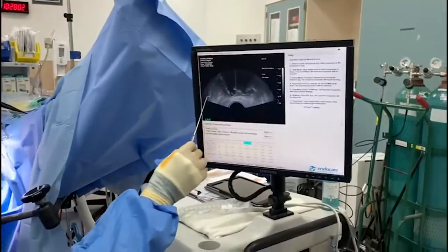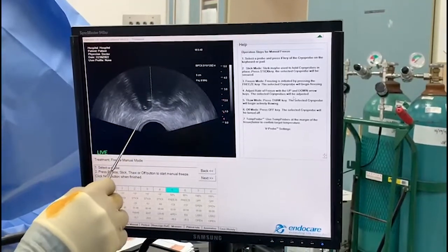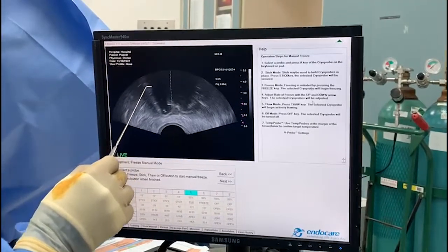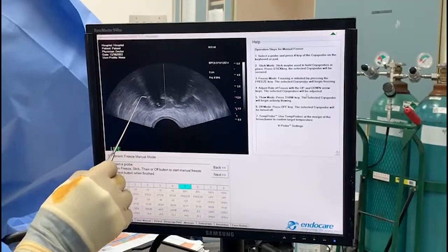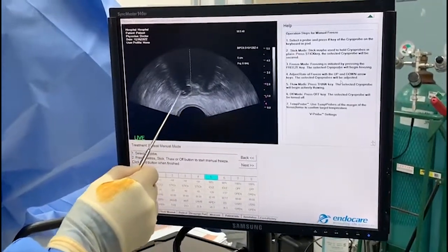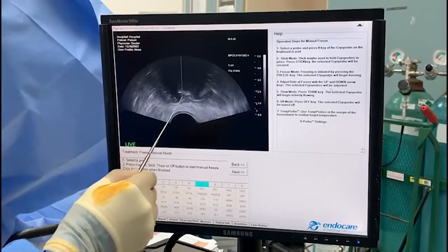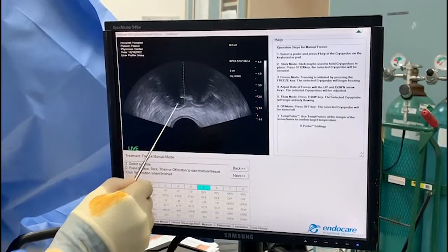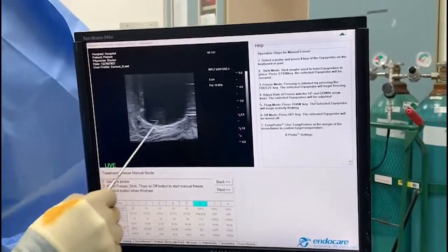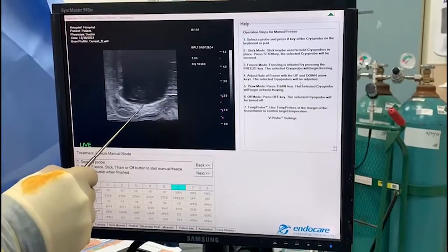The right side is running faster than the left. To compensate, I actually stop probe one since it's not really doing anything at this point, and probe three as well. We're running here, so to speed up I'm going to slow down five and speed up six to catch up. I may stop altogether at some point when we get just beyond the midline, then freeze back over. The ice ball on the right has conformed to the entire prostate — the Denonvilliers fascia is what will prevent it from going through the rectum itself.